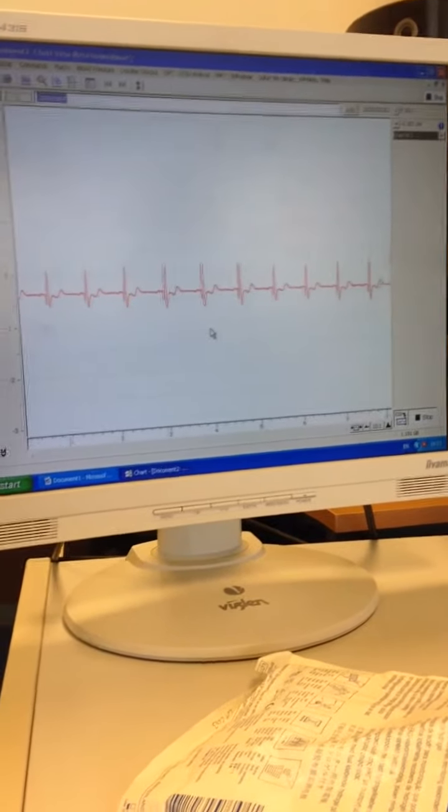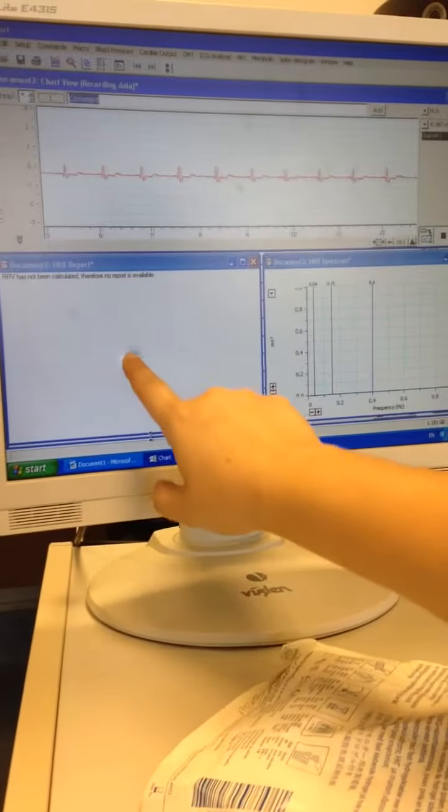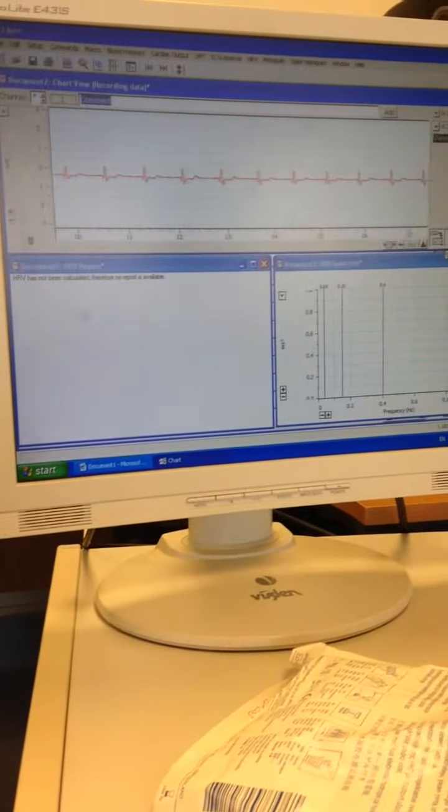I'll show how you can minimise it again just by going in that middle box. Yeah, that one. All of this is going to be your HRV analysis. So if you then stop it, you start your recording or whatever, then stop it.